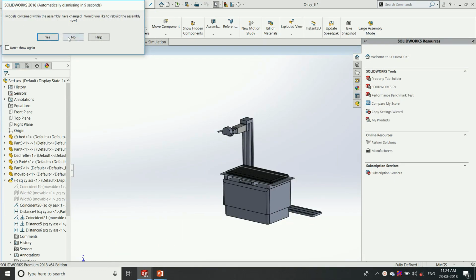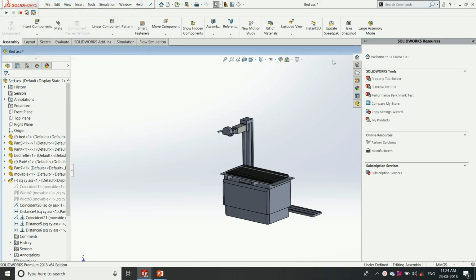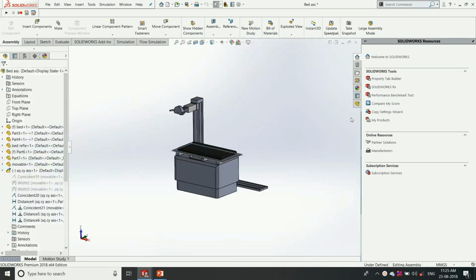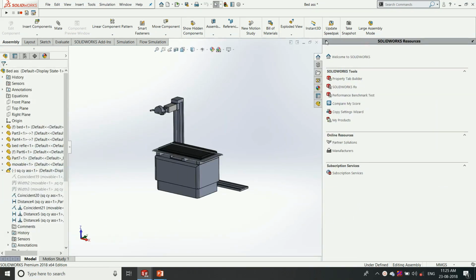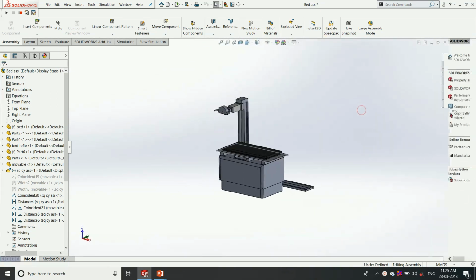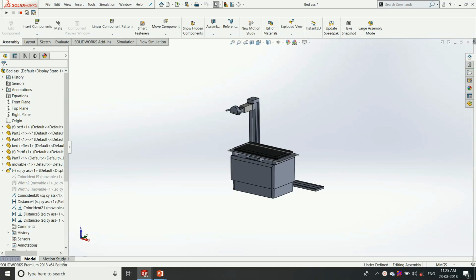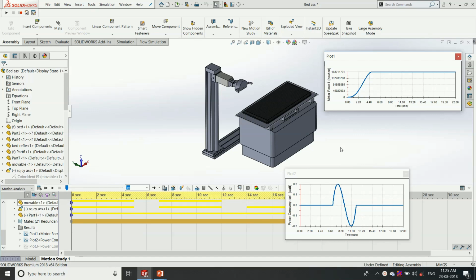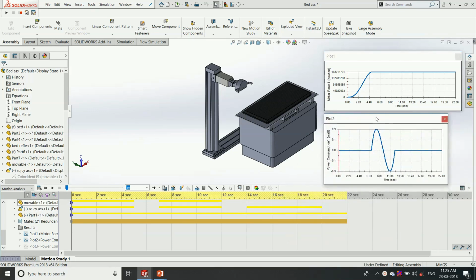Okay, so this is the component where we are going to choose the mechanisms. So by choosing the motion study we will get a list of graphs where we can choose what the power consumption of the motors is to move the arm of the X-ray machines, like that.